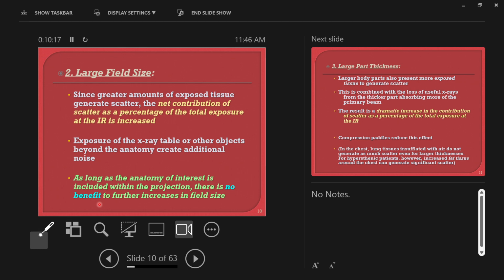Do you think eventually they'll get it precise? How do you mean? Get the equipment to line up perfectly? Definitely. It's adjusted, and it falls out of adjustment periodically. There's a light bulb inside of the collimator, and it has a little reflector, and that reflector has to be adjusted, and you can dial it in pretty close. Some offices might be completely dialed in, but most of the time there is some misalignment.